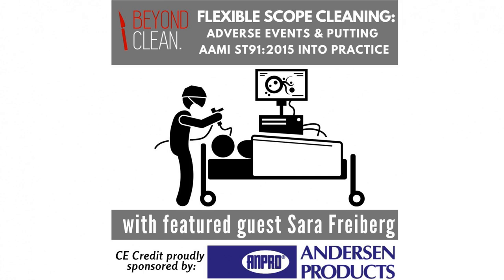We recommend placing the tubing in a dry area and, based on gravity, loosely coiling that tubing away from any potential splashes once it's disconnected from the scope and prepared for the next user. Once we confirm that that tubing is dry, we want to attach that tubing to the scope, ensure that that tubing is fitted snug, and we confirm that by gently pulling it.